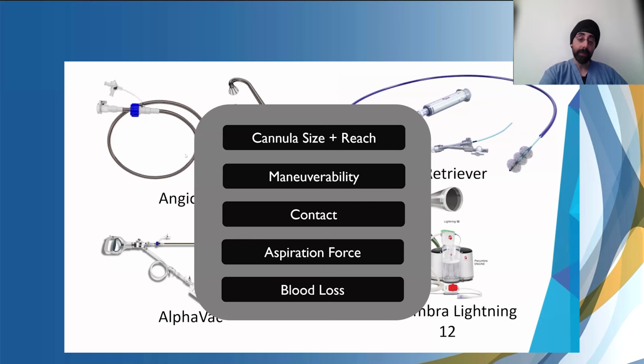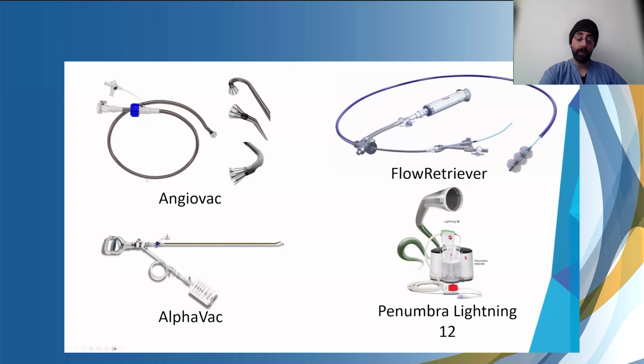If you go back for a second, you'll see these are the 4, and they have different characteristics when it comes to those things. The AngioVac and the AlphaVac are from AngioDynamics. They have a similar cone funnel shape at the end. The AngioVac is continuous aspiration with a reinfusion cannula. You'll need a perfusion setup there, so your setup would be anesthesia, TE, perfusion, and you would add it. To me, though, it's the best device for this because you have continuous, high volume aspiration.